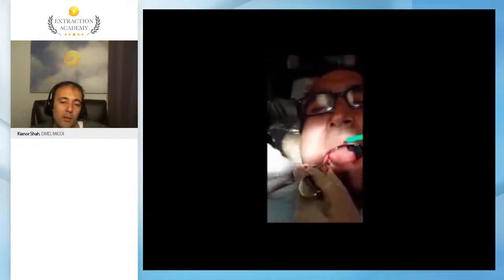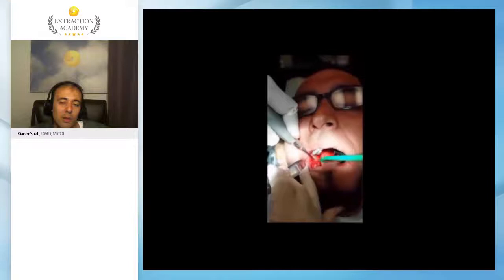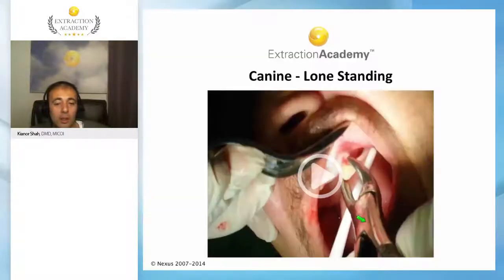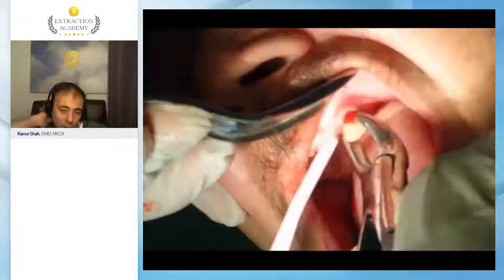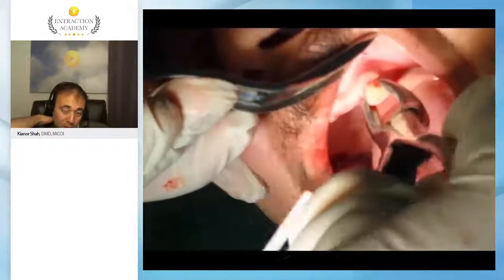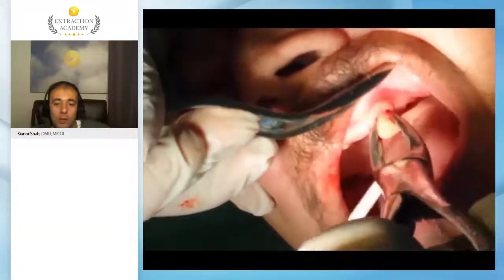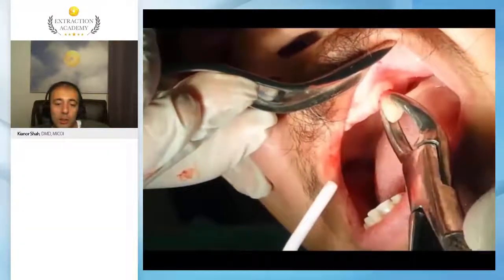In more impacted and tough cases, I always recommend that you prepare well and leave yourself quite a bit of time so you don't fall behind in your entire schedule. But also, you can use a barrier or gauze in the back of the throat to ensure that you don't have any aspiration. If you end up aspirating the tooth, you're going to need a chest X-ray, and you also have to make sure that it passes, so it's not in the lungs, which causes more complications and more intervention by medical. This is a tough scenario.